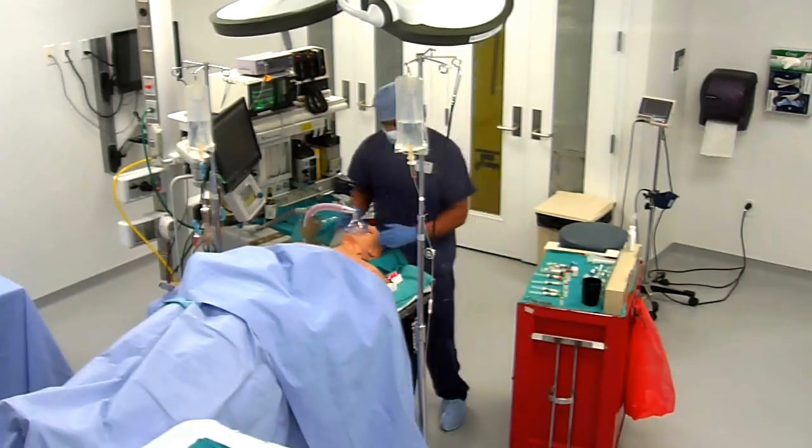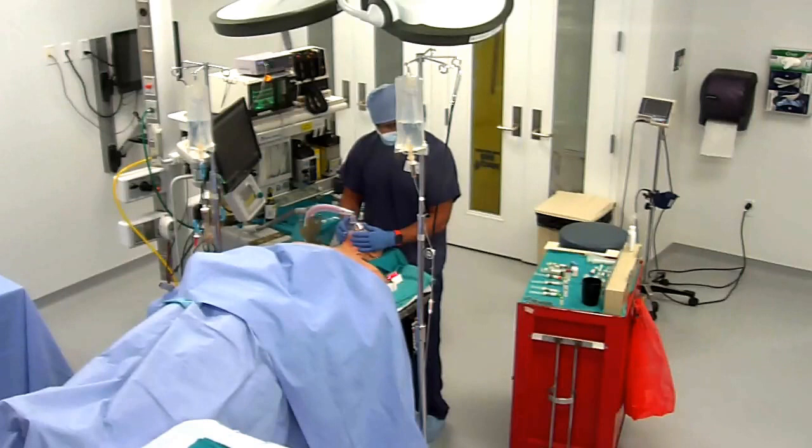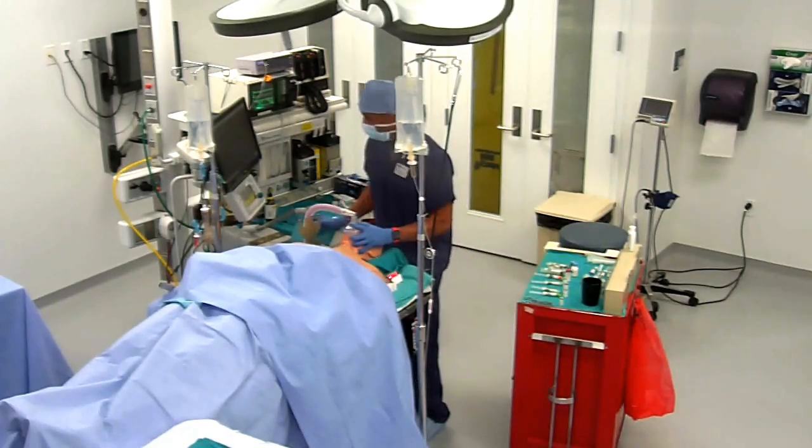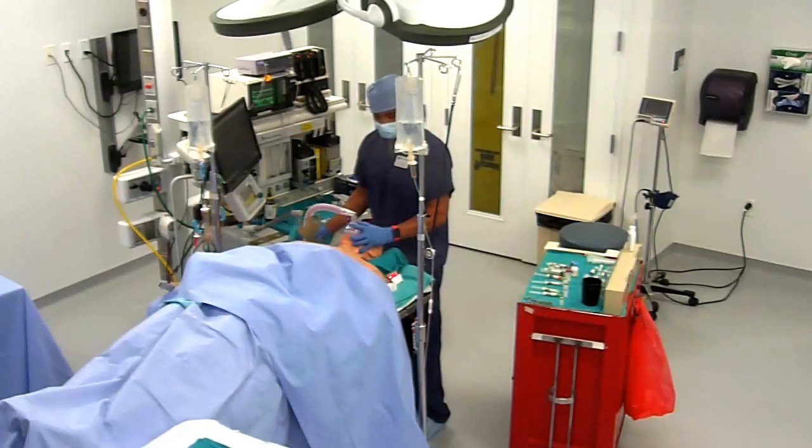So, Katie, can you take some deep breaths for me? She responded to you? Eyes are still blinking, but not talking. Okay, she is asleep. So first thing, I'm going to create my C-seal, and I'm going to pad Katie and make sure that I have an airway. Getting the feel. Airway good? I have an airway.